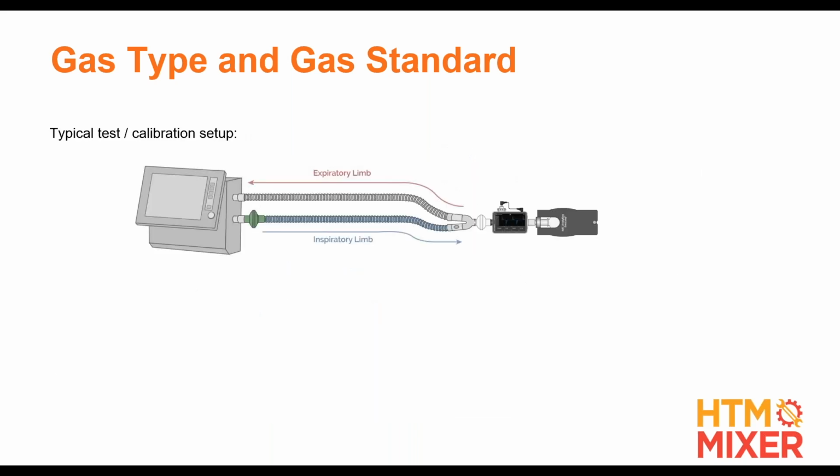So what happens when we test the ventilator? Do we have a humidifier in line? If we do, it's not turned on and it's not full of water, right? It's only in there for volume of the circuit. So when our ventilator setting is saying 560, the ventilator is still putting out 500, so that's what we measure.